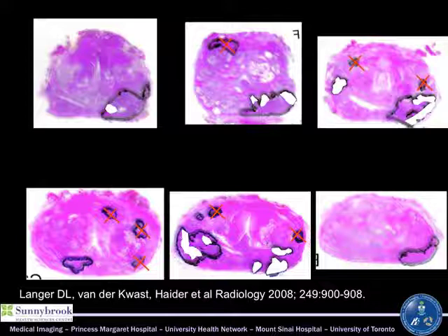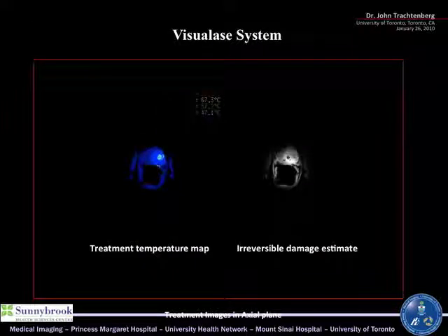But it's something to consider for focal therapy, that MR alone, if you want to eradicate the entire tumor focus, including the Gleason 3 components, is not going to be adequate to draw a boundary. You need to put a margin on. You need to make a decision whether Gleason 3 for you is important in this paradigm of focal therapy.